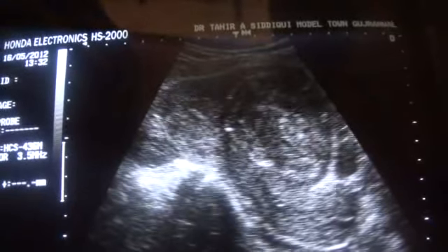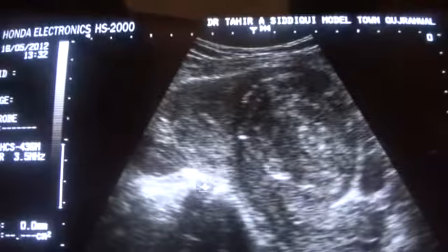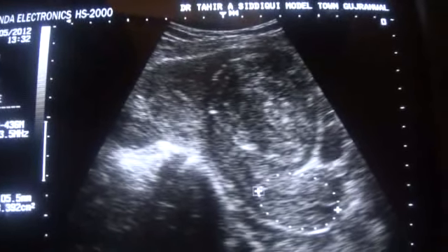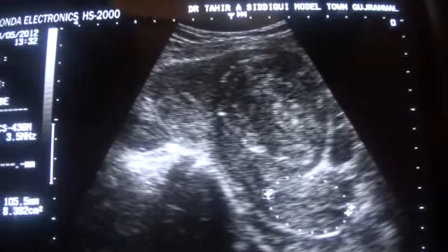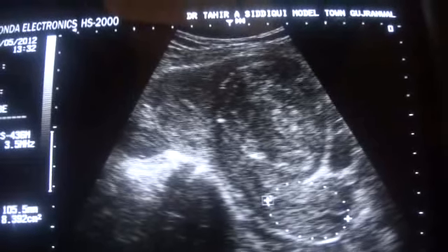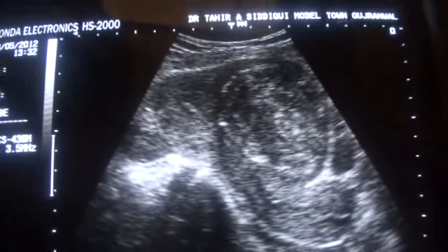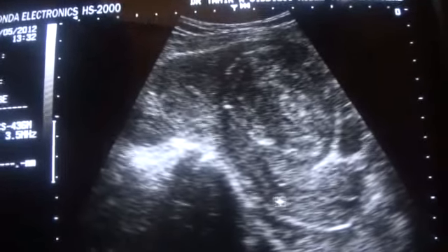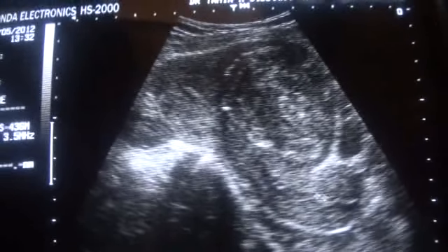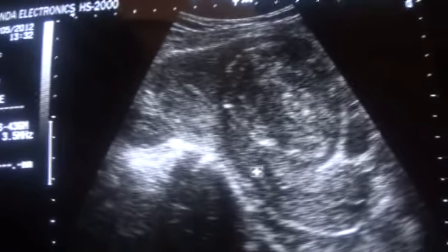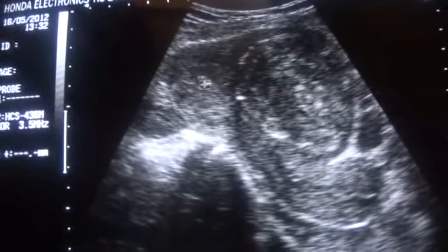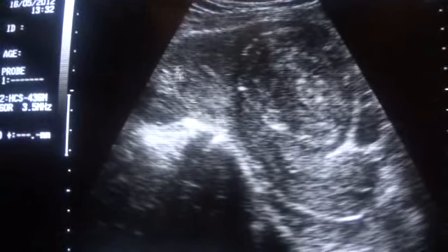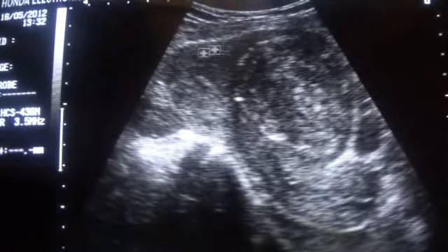This is the cervix. This is the cervical canal in longitudinal view. This is the anterior lip of the cervix, this is the posterior lip of the cervix, and in between is the cervical canal, which is continuous with the endometrial canal. This is the fundus of the uterus.